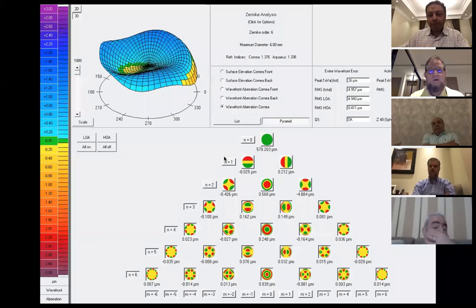There's a question. You mean the one with the high astigmatism? The high astigmatism or the high order aberrations, which of course, high order aberrations. Also about the pupil size. I asked him about the pupil size, it should be 2 to 6 optimal, 4 to 4.6.